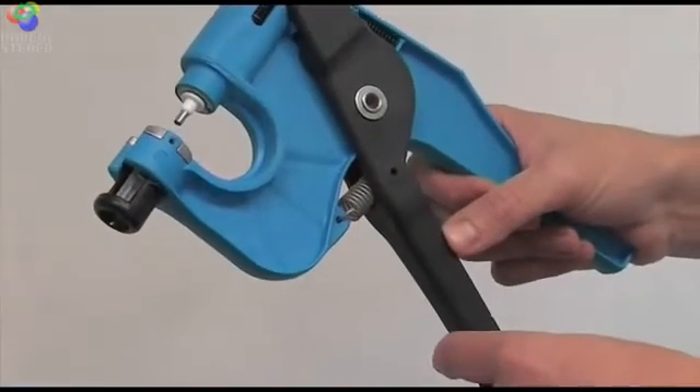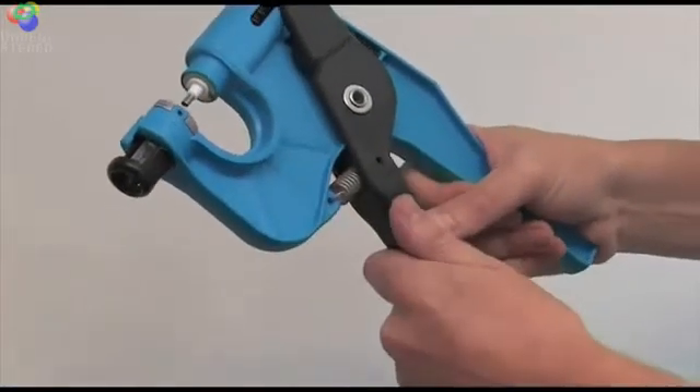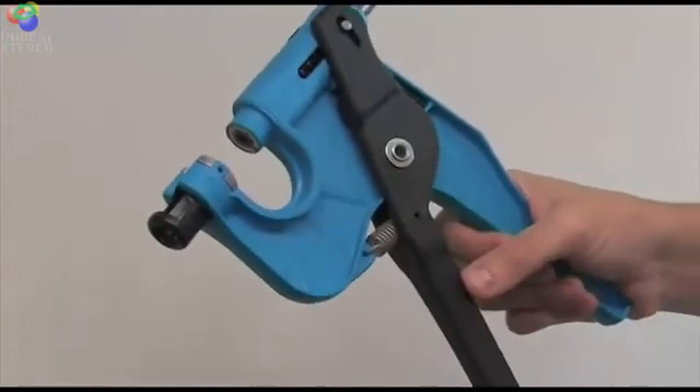When a sample has been taken, remove the cutter from the gun by pulling the handles apart. That will cause it to drop out as shown.